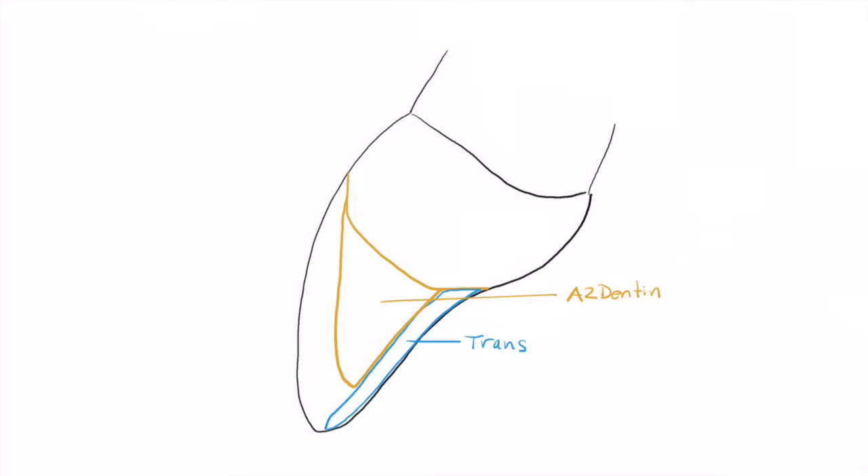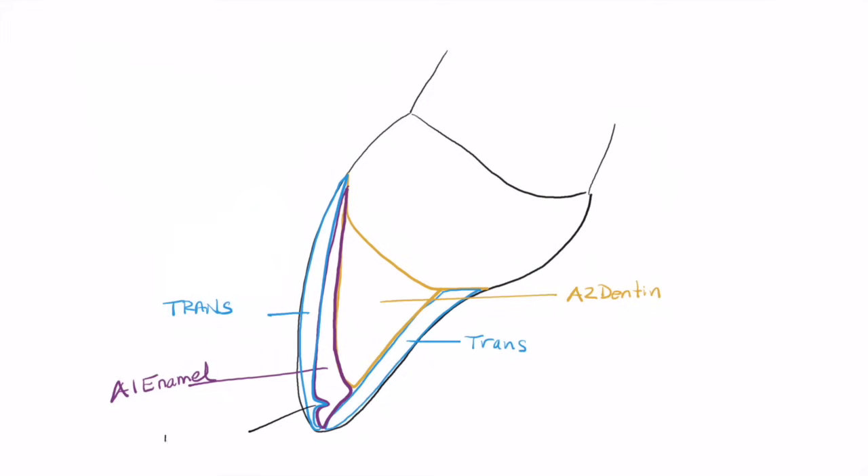Dentin shades are significantly more opaque than enamel shades, and that's a great advantage. We'll then lay on top of that an area of enamel, filling in between the lobes laid down with the dentin. In this area we'll use either an A2 or an A1 enamel — we're planning on A1 enamel. You'll notice there's a little notch down at the incisal area to create a halo effect, and the area on top will be translucent.